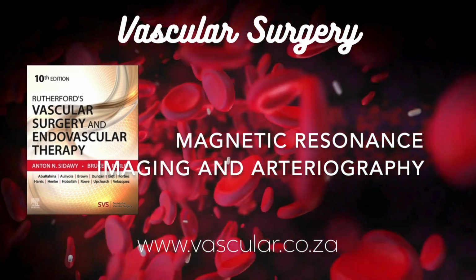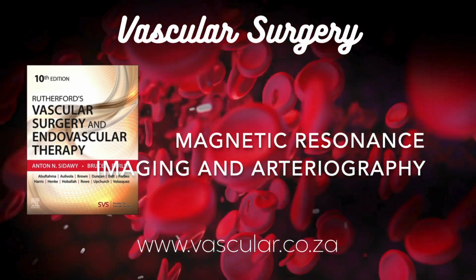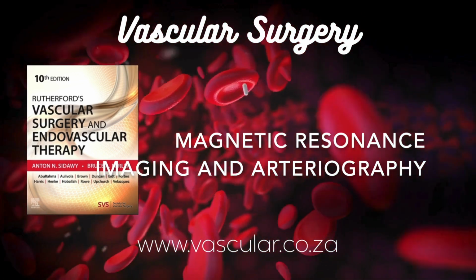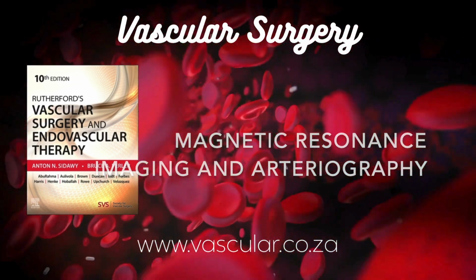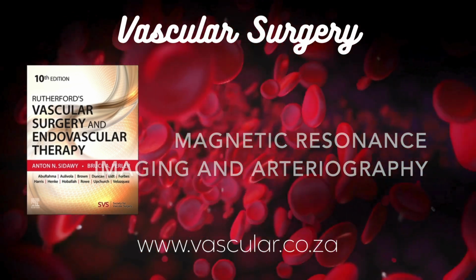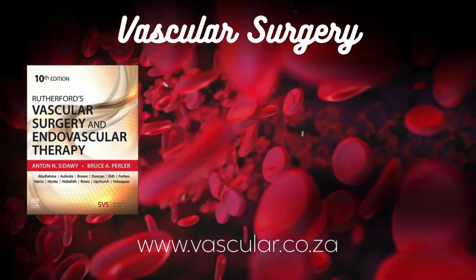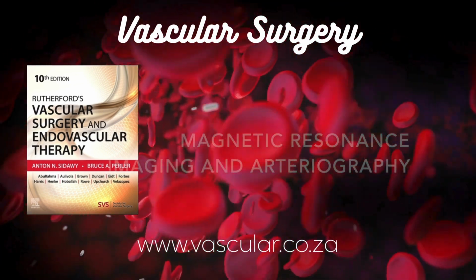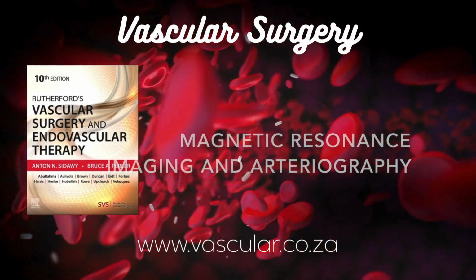Are they a problem? Generally less of a problem from a safety perspective. Most modern stents, filters, and coils are made from non-ferromagnetic or weakly ferromagnetic materials like nitinol or certain stainless steels. So they don't get pulled by the magnet. Not significantly, no. They're usually rated MR safe or MR conditional. There was an older stainless steel aortic stent graft that was initially an issue, but even that's now conditional up to 3T after it's had time to embed.